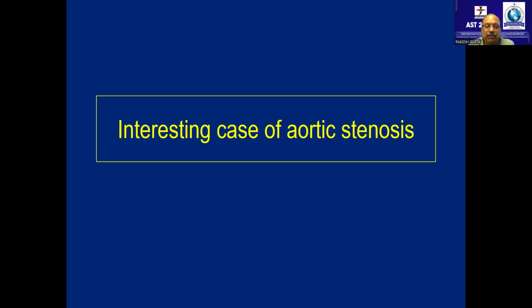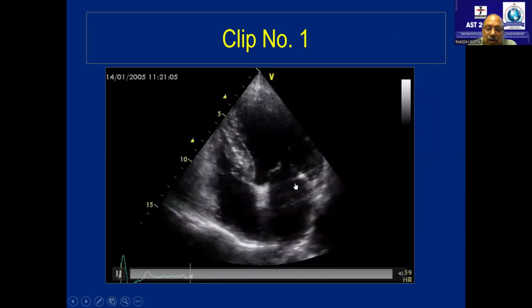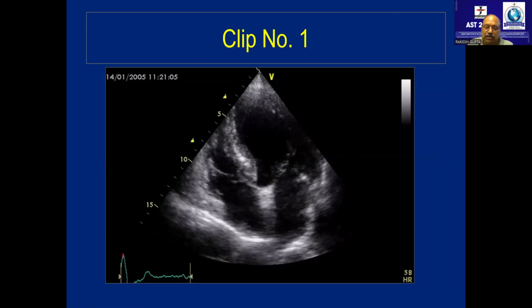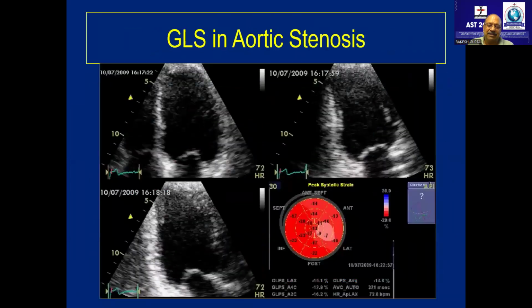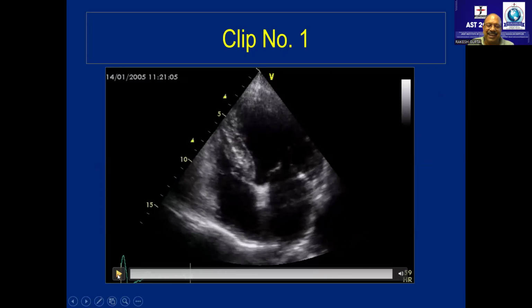She wanted to ask how to calculate mitral valve stroke volume. Go to the 4-chamber view, look at the hinge points, join them together during diastole. That gives you the diameter. Divide by 2 to give you the radius. Pi r square will give you area. Then do a pulse wave Doppler spectrum across the mitral valve, trace it, and get a VTI. You'll get the stroke volume across the mitral valve. Is that clear, Dr. Janvi? Sir, please repeat. I was also confused about what ma'am asked. Please, slowly.